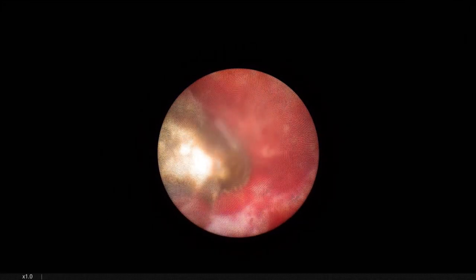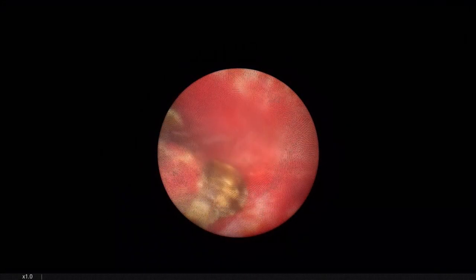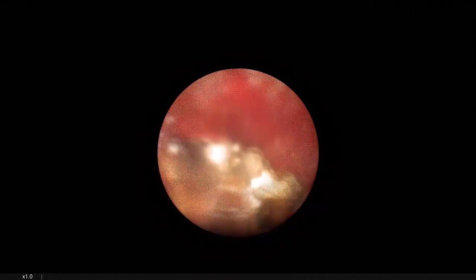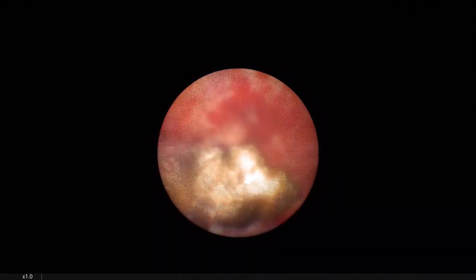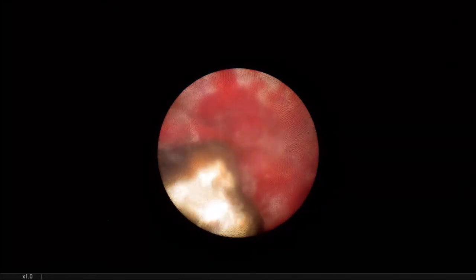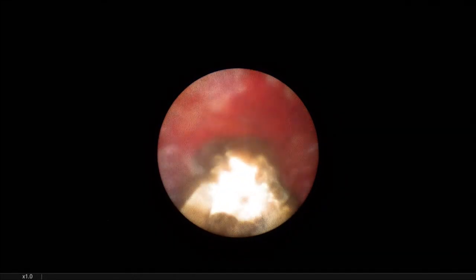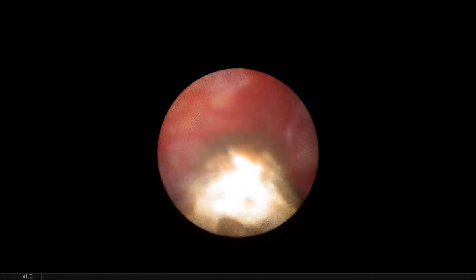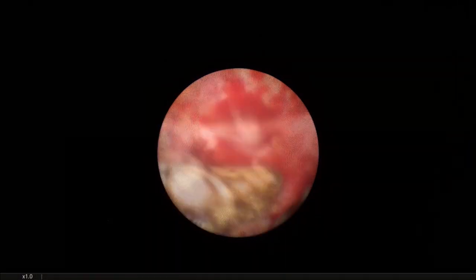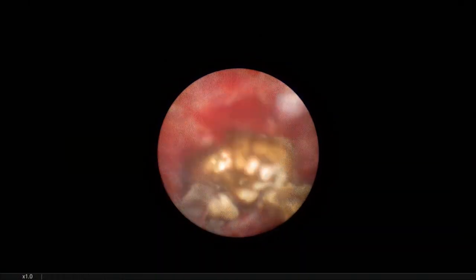Very tough stone. You are in mode dusting or fragmentation? This is for fragmentation, high energy and low frequency. Yeah, this is fragmentation. 1.5 joule and 8 hertz. You always should have a look at the stone, how it responds to your disintegration.